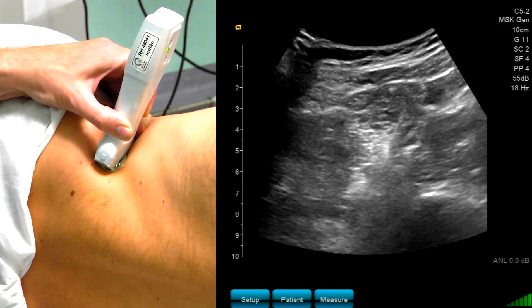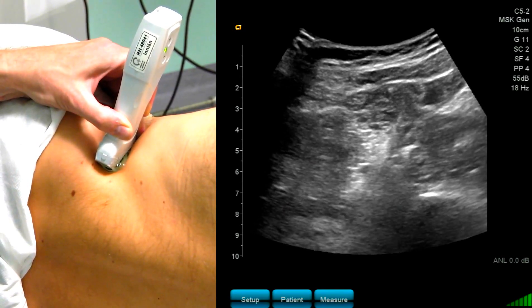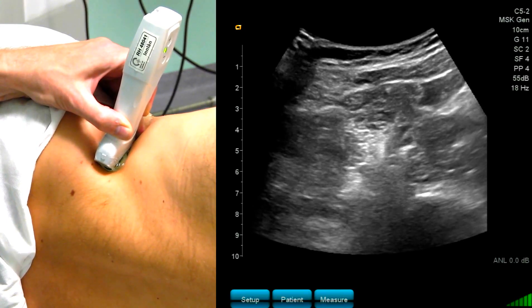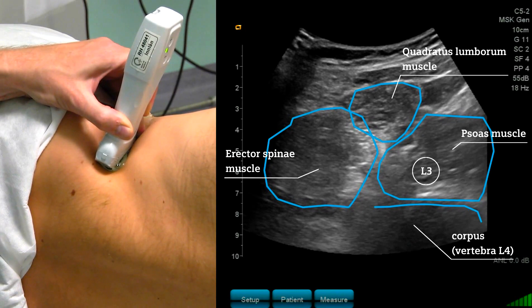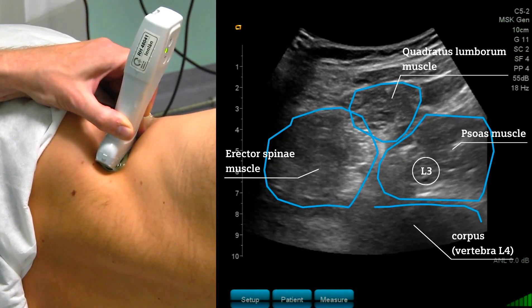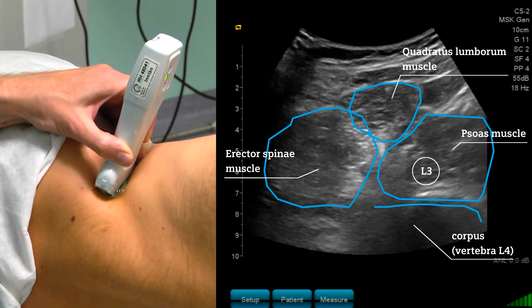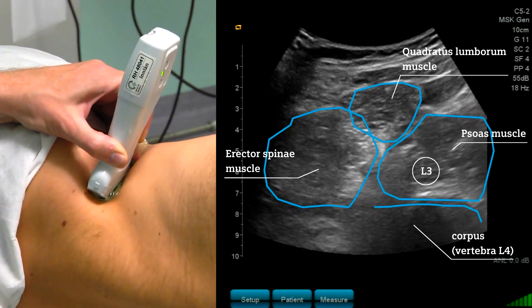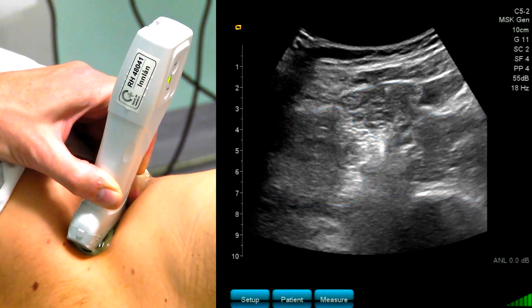This makes us prefer the lateral side of the nerve for our needle position. I can clearly see the nerve and I still see the three muscles of the shamrock, the three leaves that are surrounding the shaft and the transverse process in the previous image.